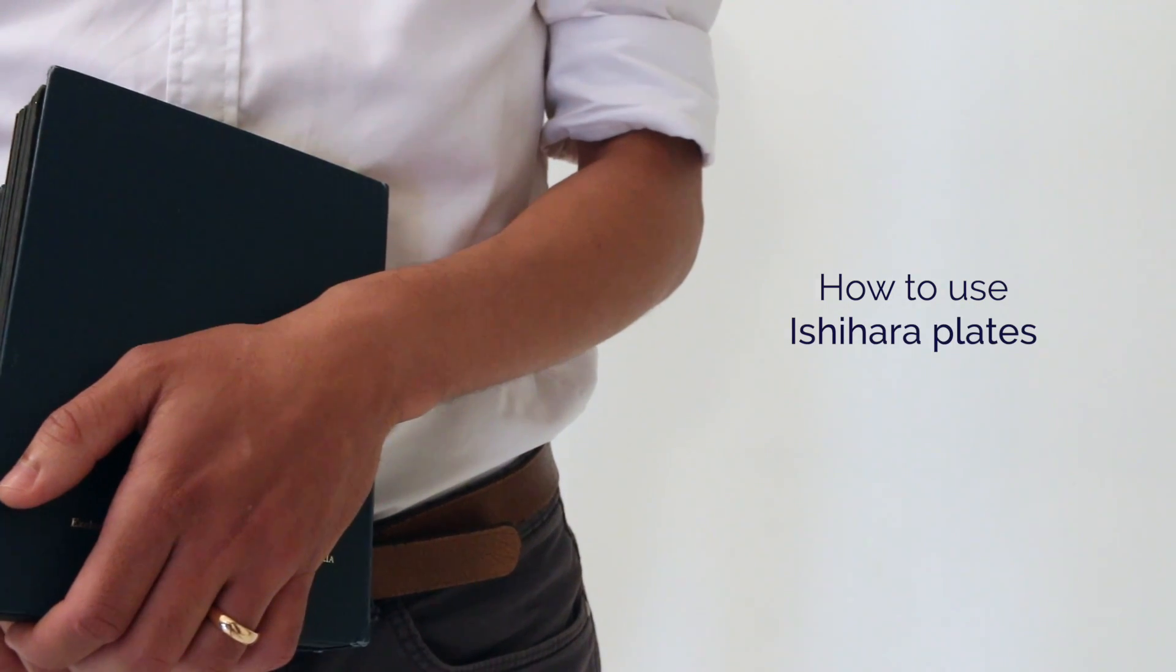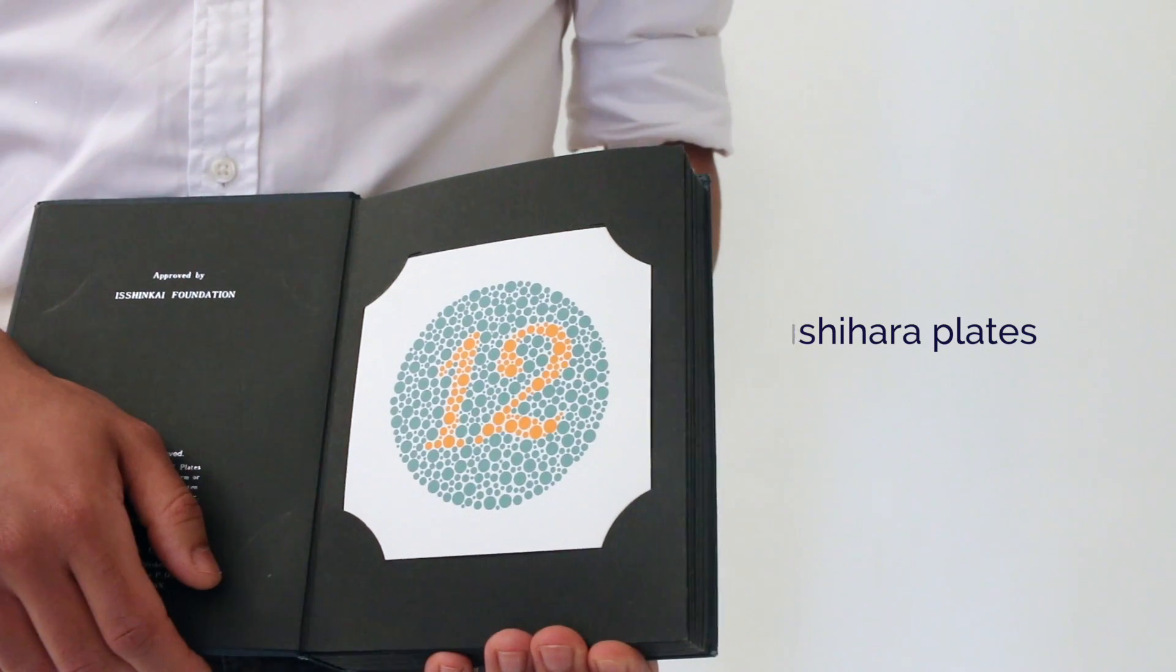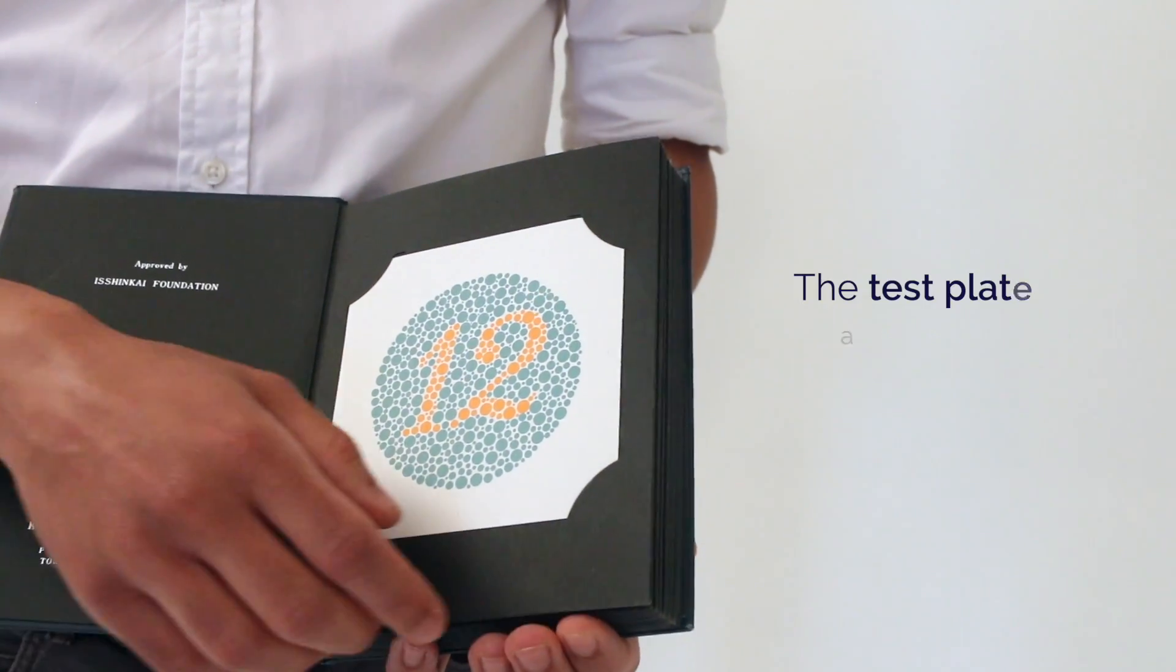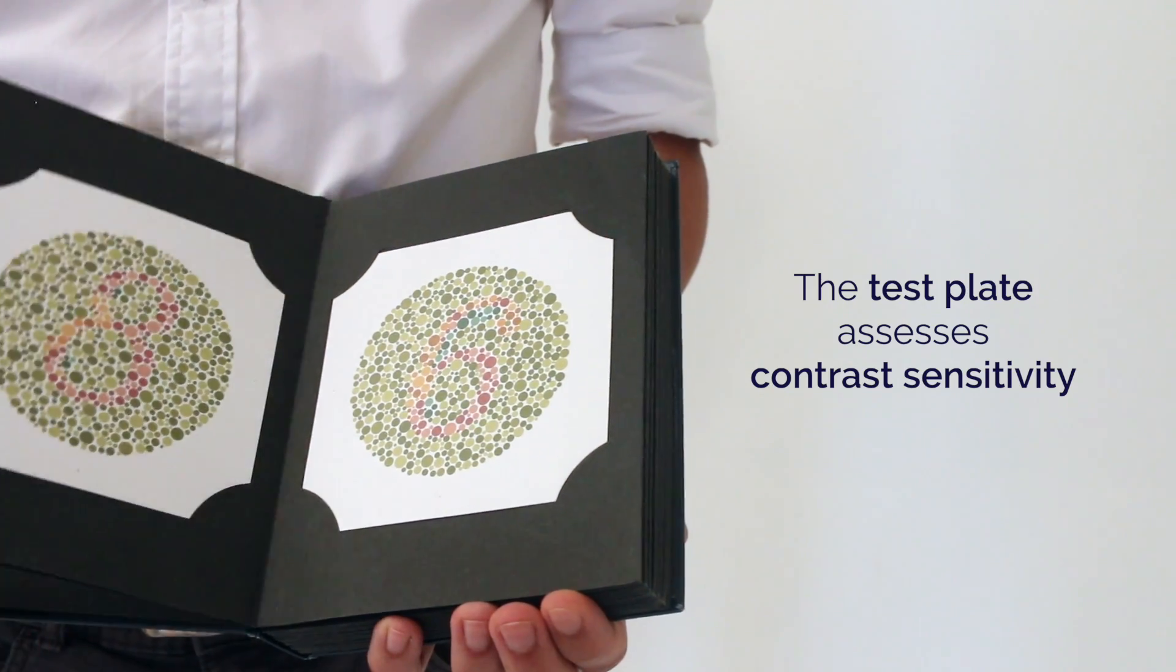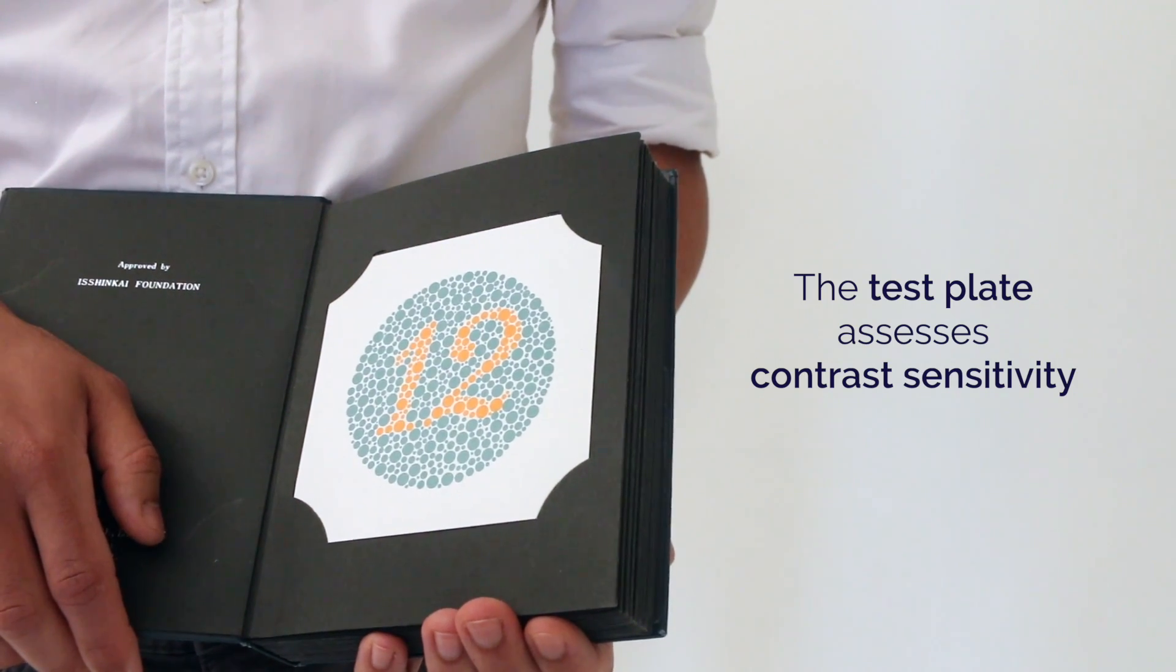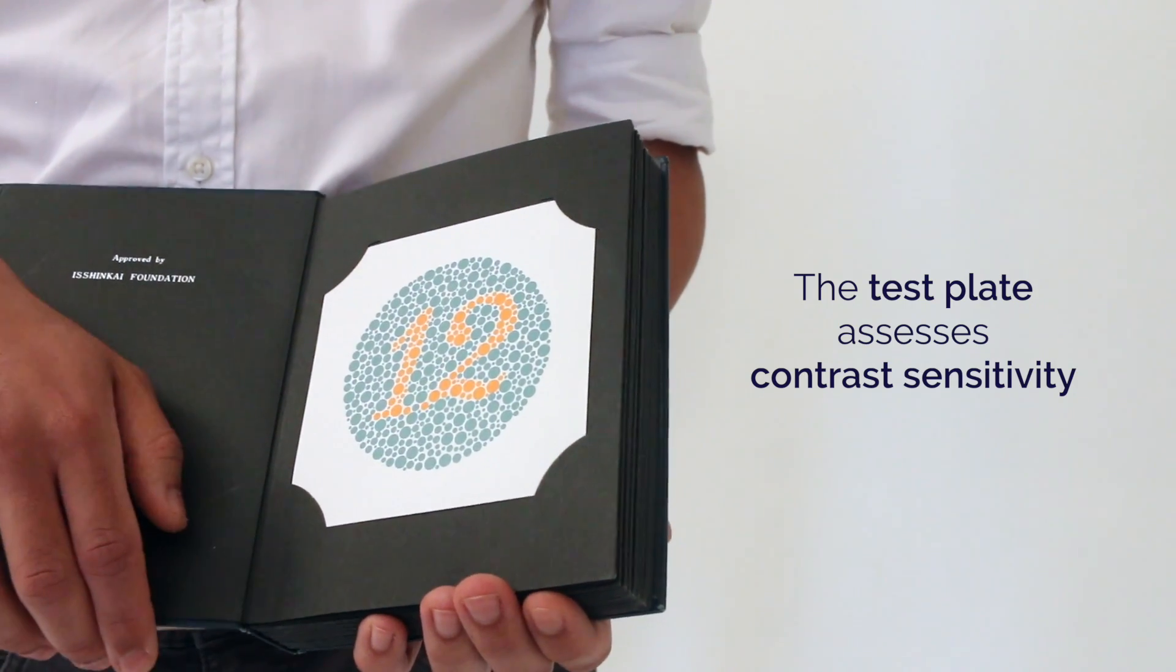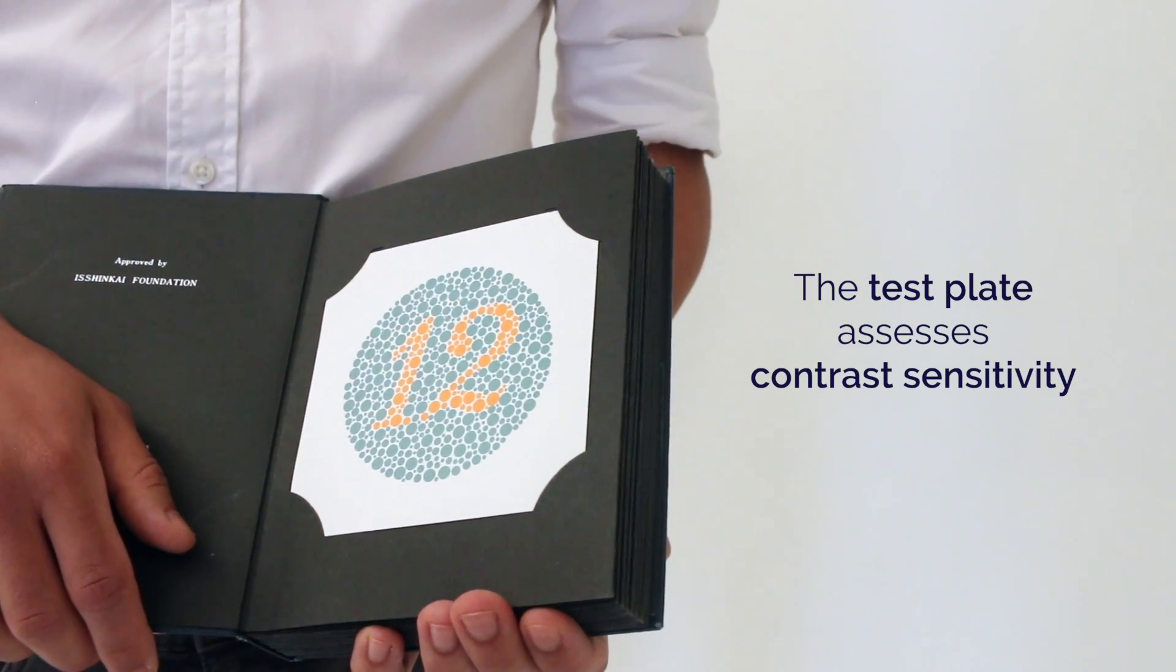To examine colour vision, we use Ishihara plates. The first plate, the number 12 here, you can notice it's different to the other numbers. It's much easier and it's not a test of colour vision. It's a test of the patient's ability to do the test. So if they can't see this number, there's no point in proceeding with the Ishihara.